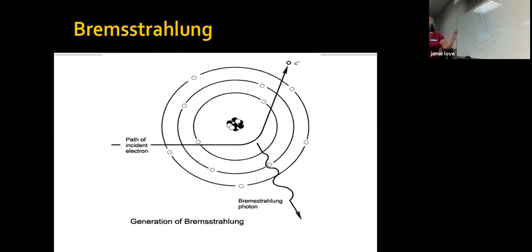So if I have 100 electrons coming across, each one of them hitting the target with 2 chances of hitting a characteristic each time, or a whole lot more chances of becoming close to that nucleus and losing some energy. Bremsstrahlung is more prevalent. More chance of this happening than these two getting exactly hit. So we have characteristics and Brems. Bremsstrahlung are more prevalent in the tube.